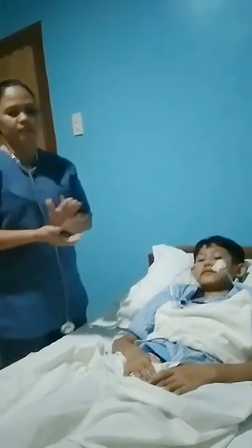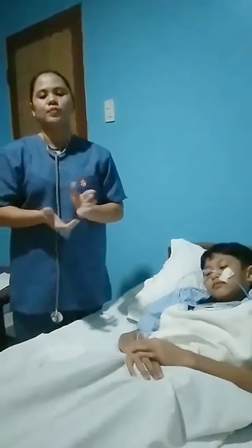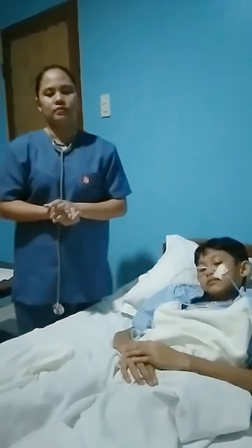Yes. Thank you. Great. For the documentation, we have to initiate intake and output record. Also, we have to document the type and size of the tube that was inserted. Furthermore, we have to document amount and characteristics of the drainage. Next, we need to document our patient's response after procedure. Lastly, we have to add to nursing care plan the information for care needed.